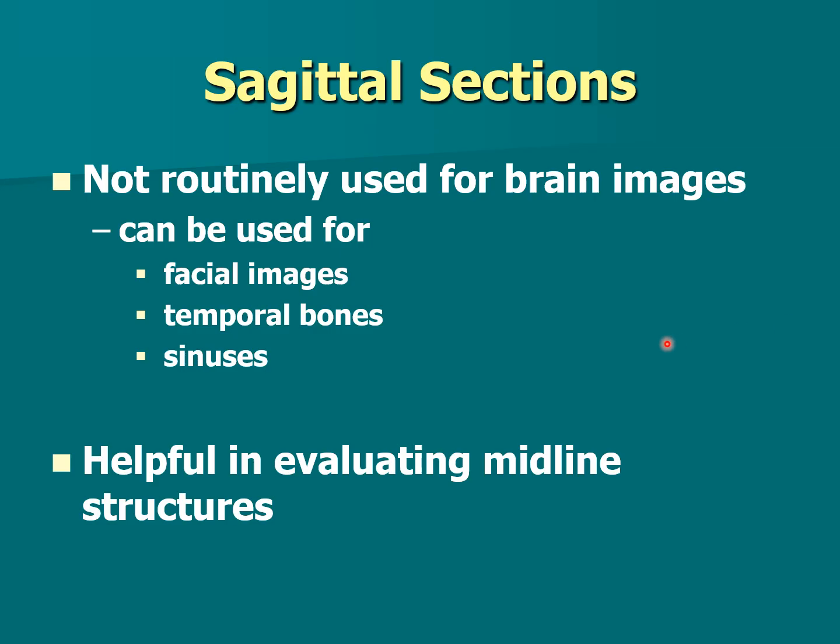Sagittal images, your book says, are not routinely used for brain images. A lot of the places where our students go here in the Houston area, at least, which is what I'm familiar with, automatically do sagittal planes also, because it doesn't cost any more, you're not doing it on film, it just may take a little more time. Even though it said it was not usually done routinely, you will just see in your own place whether they use that or not.